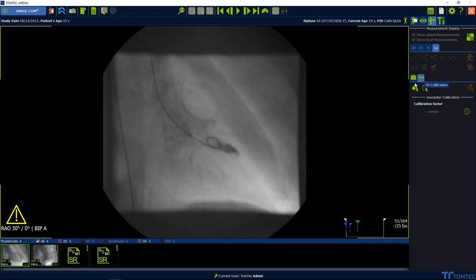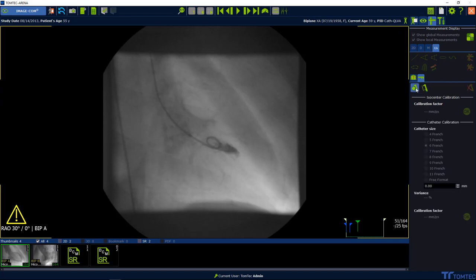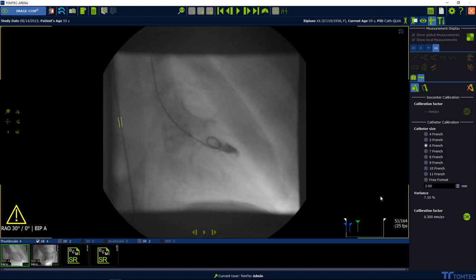Select one of the options to calibrate the image. Here, please focus on catheter calibration, the most common calibration method. Click on catheter calibration and then click two times on a straight part of the catheter.